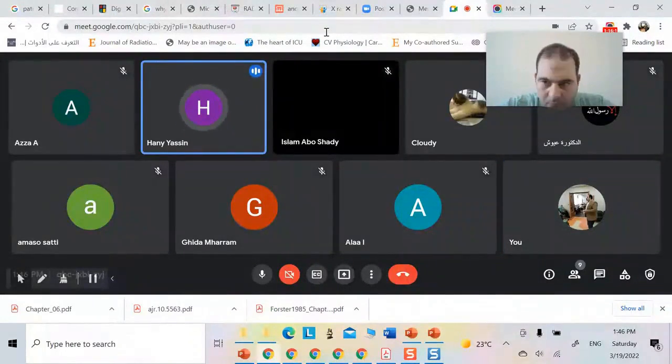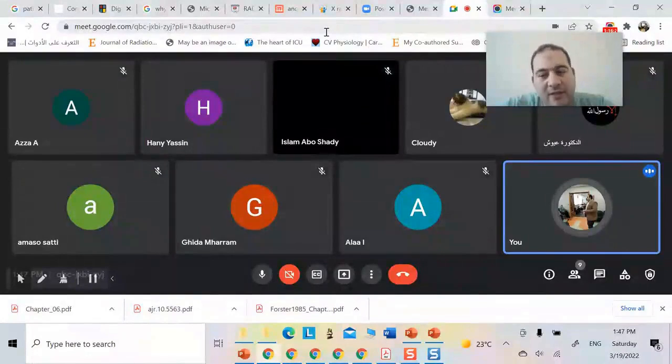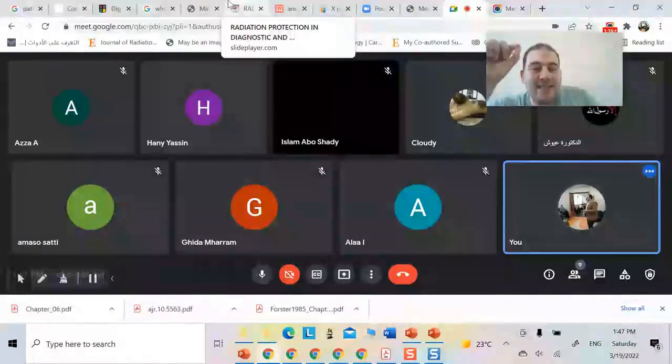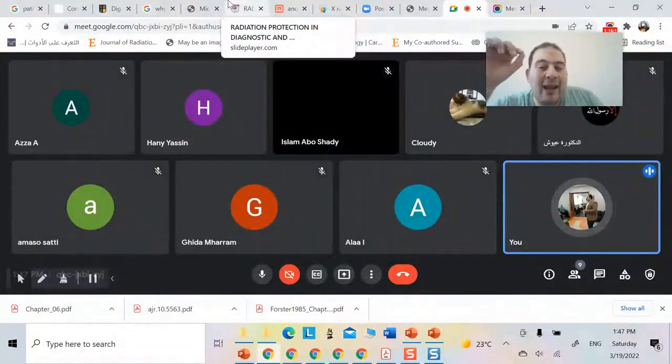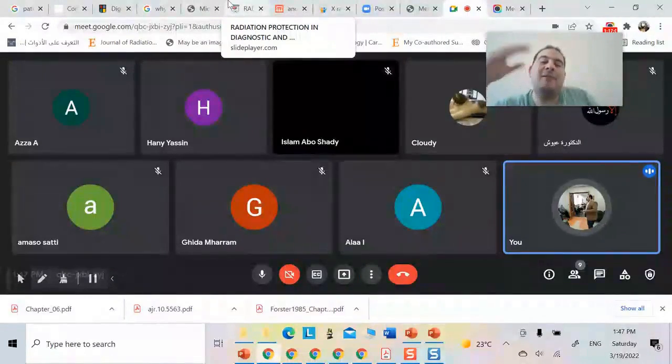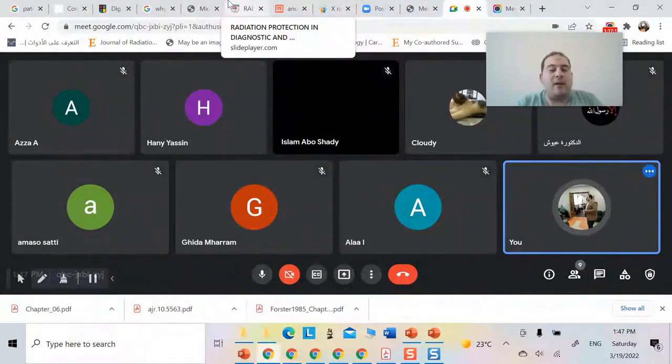For example, when we talk about CT, computed tomography, is it adjusted automatically? There is an option in the devices called automatic exposure control. This is exactly what we are talking about, but it does it in a different way. It takes a scout and calculates what you want to work on, for example, the chest. It analyzes each pixel and its attenuation level, then adjusts the milliampere. In the chest there is no high attenuation, so we set a low milliampere, while the abdomen is set slightly higher, and for the bone we set a higher milliampere. This is automatic. You do not control it or enter a specific value.